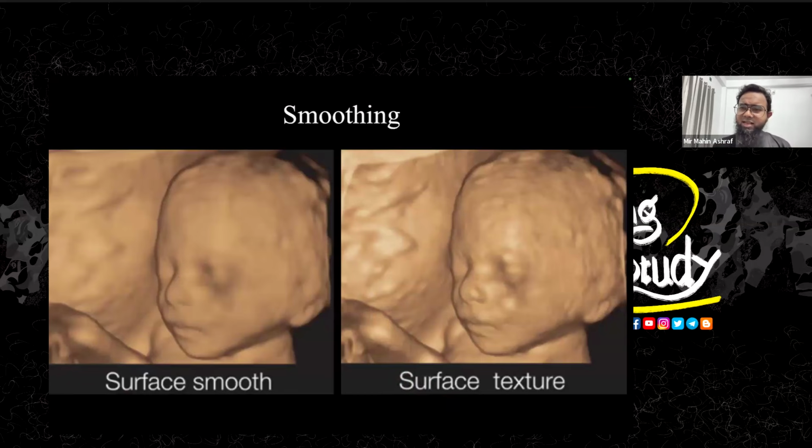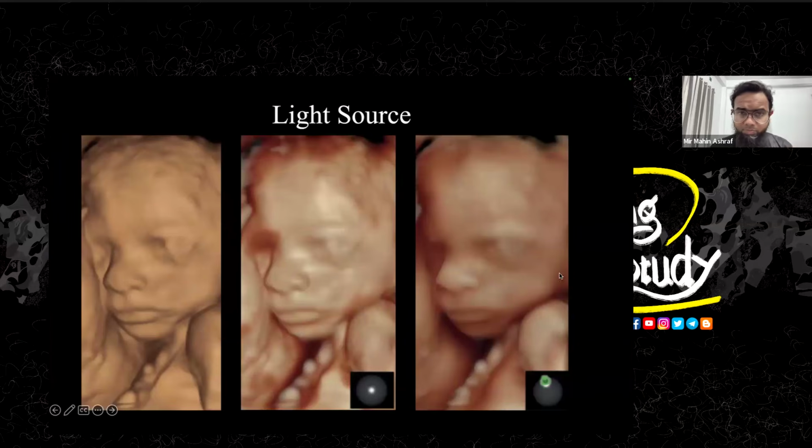There are some adjustments also, like if you think about a picture on your mobile phone, you edit it a lot, so your face doesn't look like you. Like what we see on Instagram or Facebook. You have to edit like that. There are so many options, like a smoothing option with which you can smooth or make rough skin or texture like skin. Whatever you like, you can change with the smoothing or texture option.